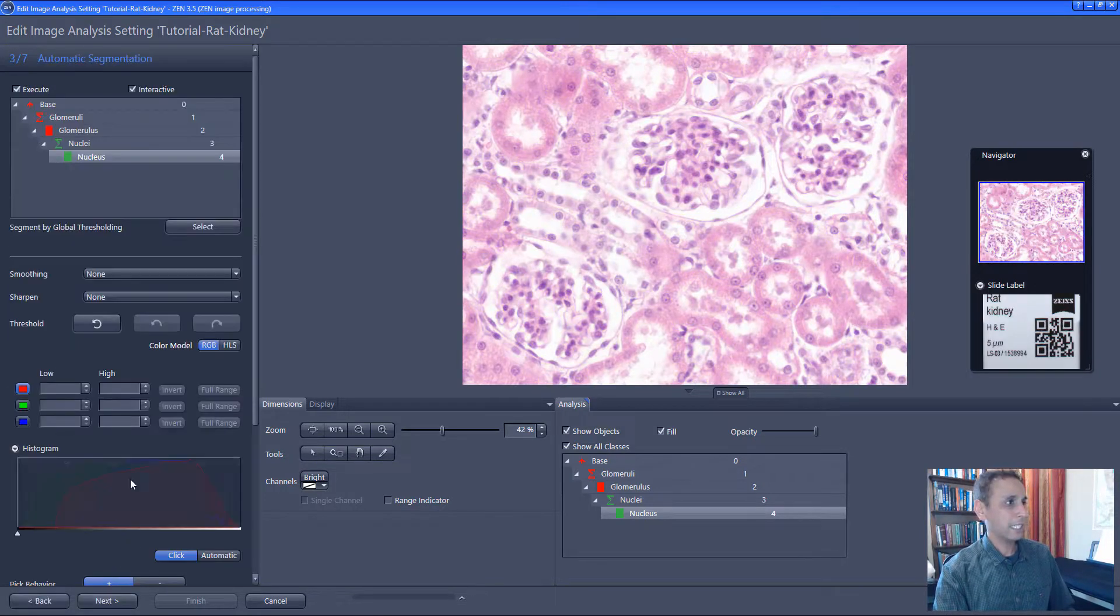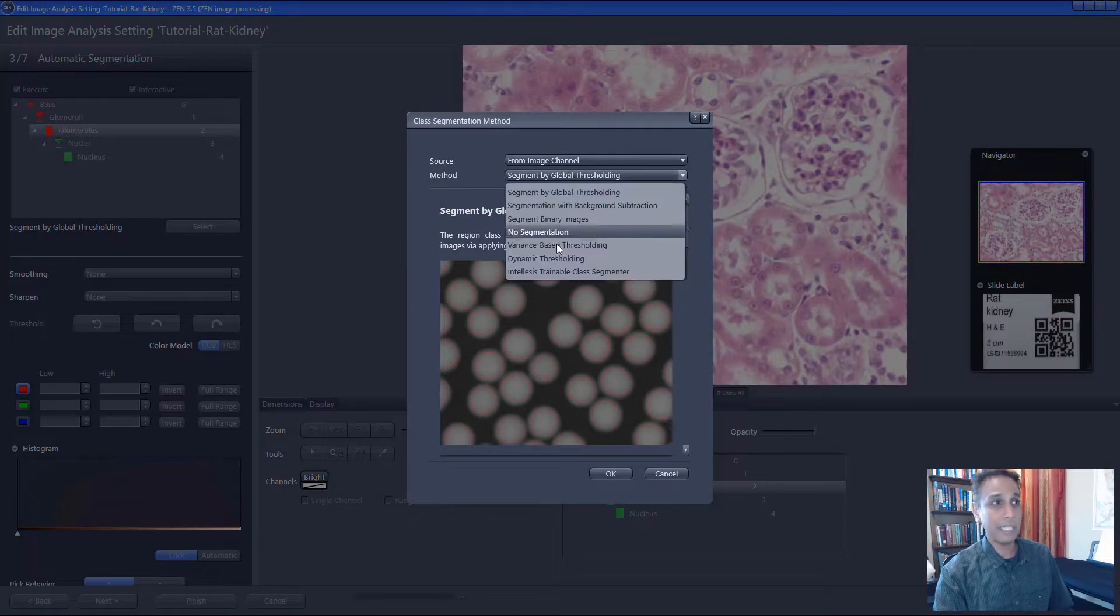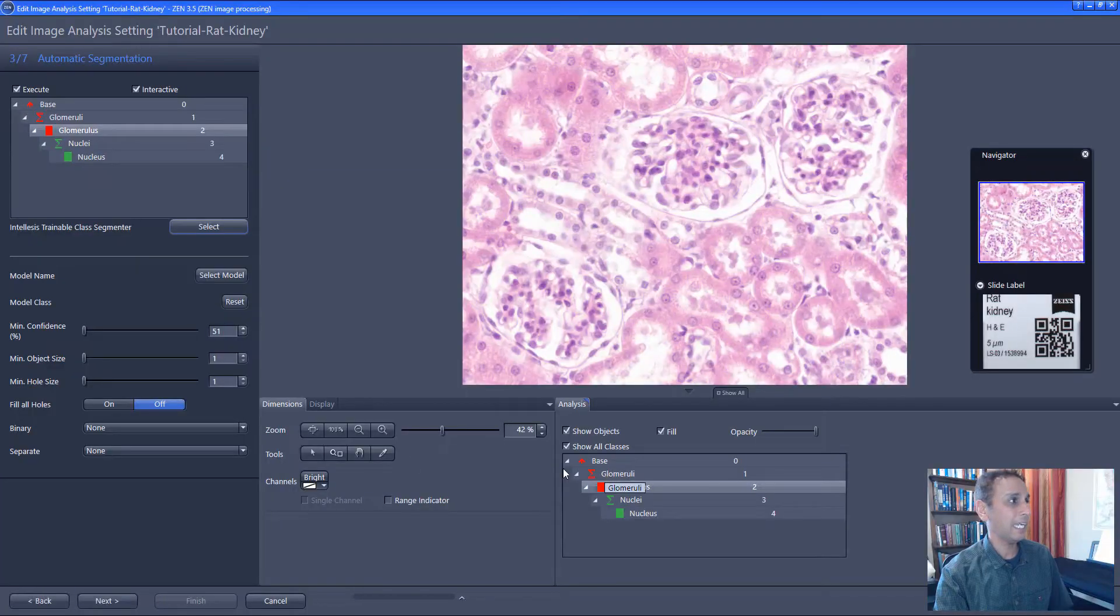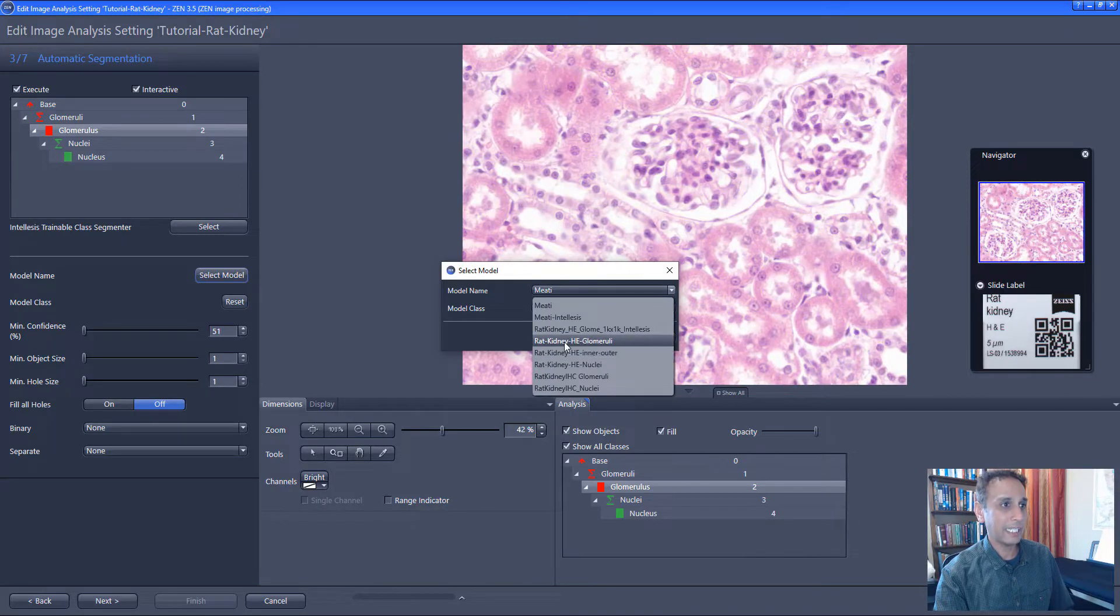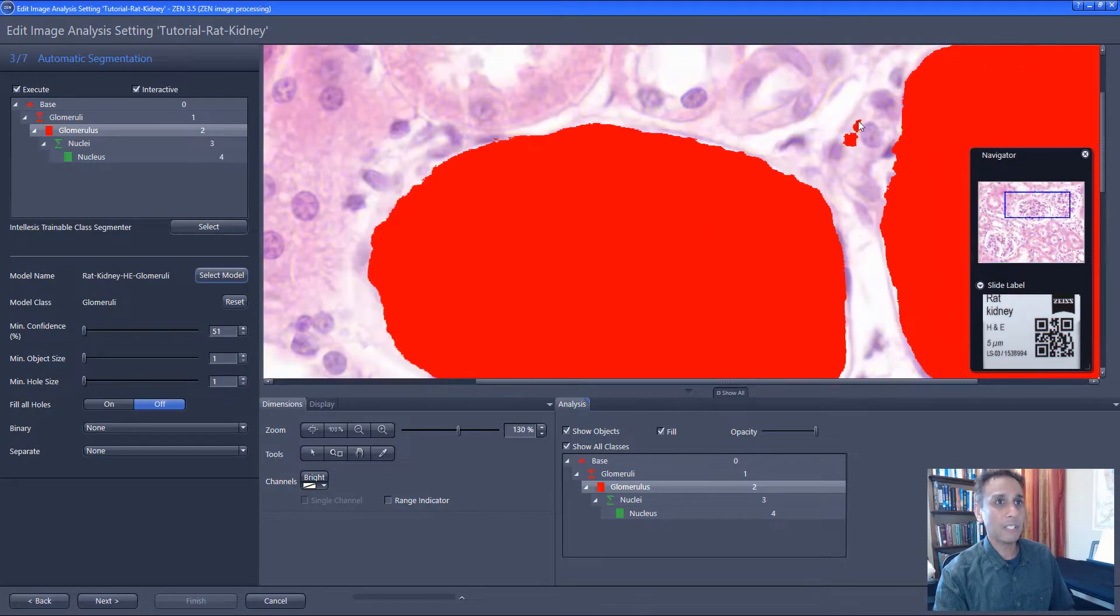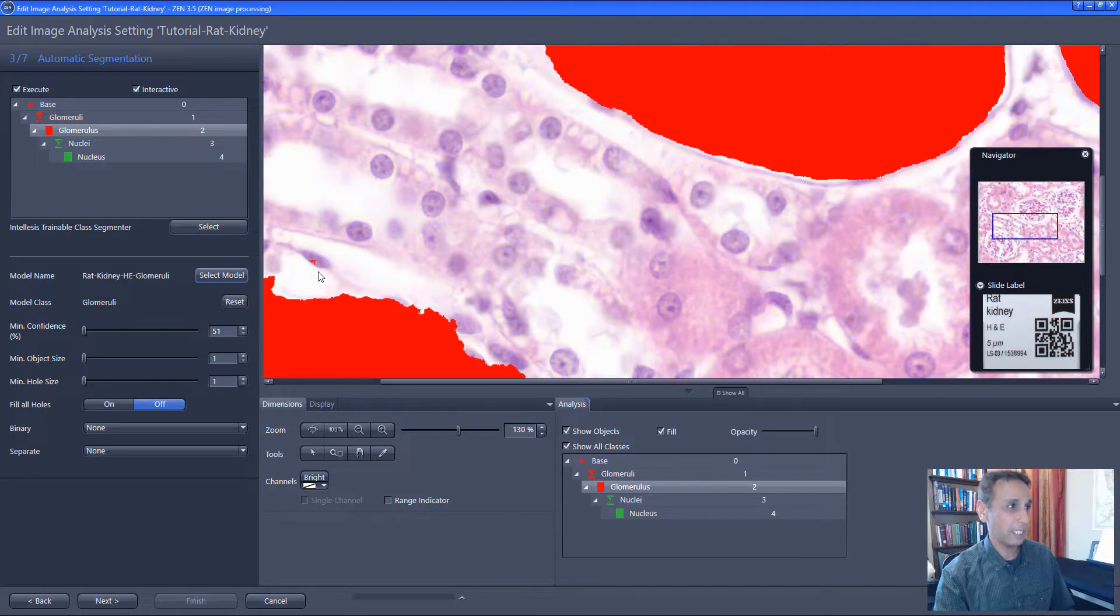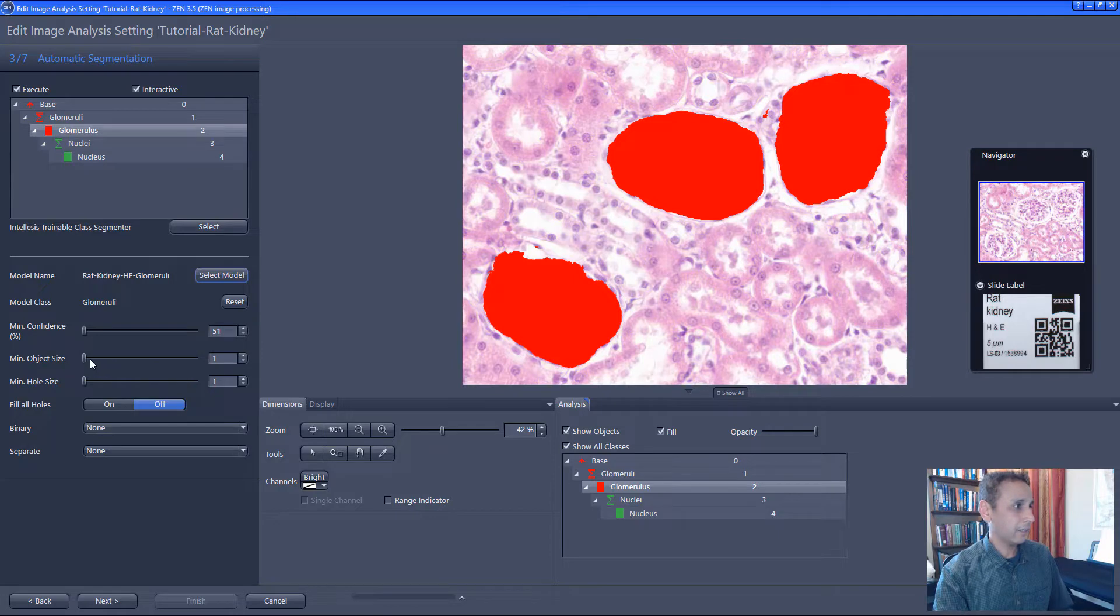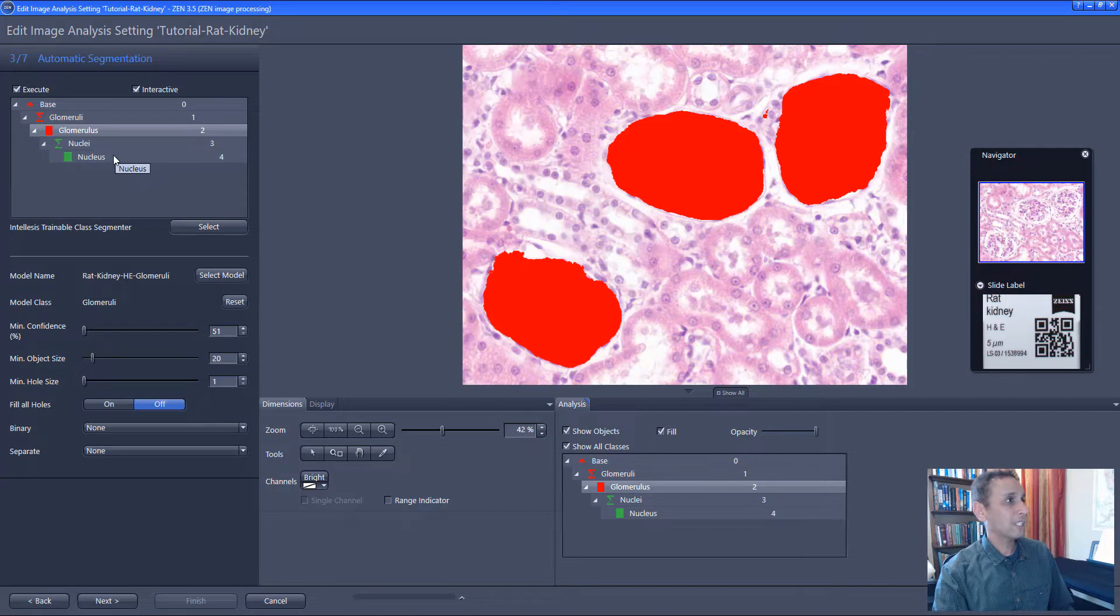Not much here. Let's go next, and we need to do something here. So how do we detect glomerulus? Not by global thresholding, but by using deep learning. So for that, let's select IntelliSys trainable class segmenter. Say OK. And now we need to select the right model. So the right model is our rat kidney HE glomeruli, and we need to segment the glomeruli, not the background. So there you go. It's showing me, and there are certain little regions right there that need to be cleaned up. Again, you can get a better model, but you'll always see some areas like this. But we'll take care of that later on. In fact, you can take care of that by just sliding this minimum object size. I don't do much processing right here. I'll just leave it right there. We'll take care of it later in the next screen anyway.